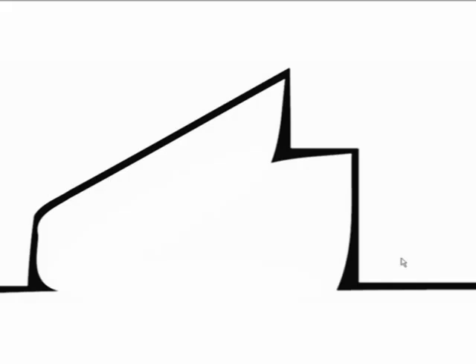All right, this is a ventilator pressure waveform on a volume control mode like the one we're using. And what happens is the air rushes through the endotracheal tube, the tracheobronchial tree, and you'll see very high initial pressures. Those are called peak pressures.